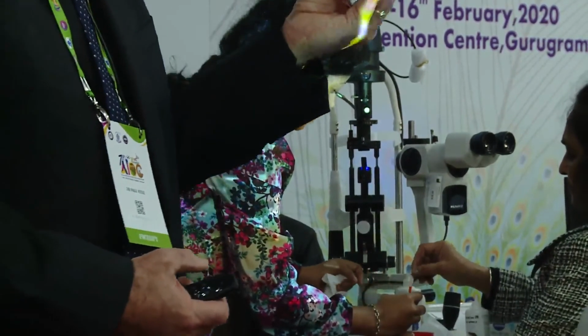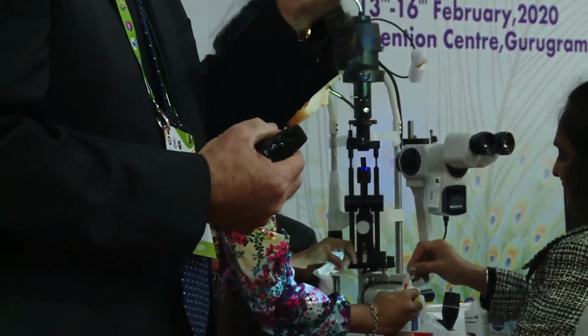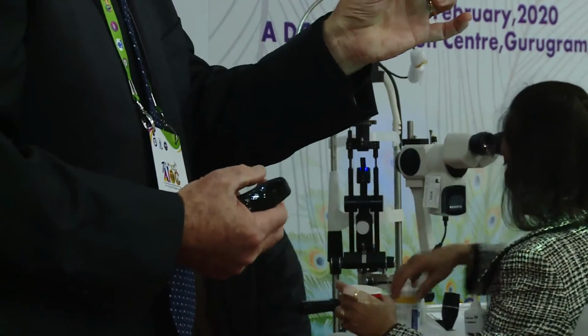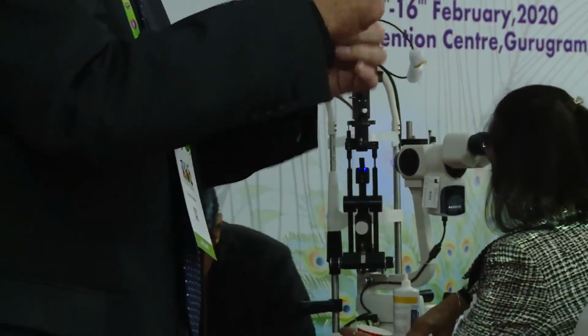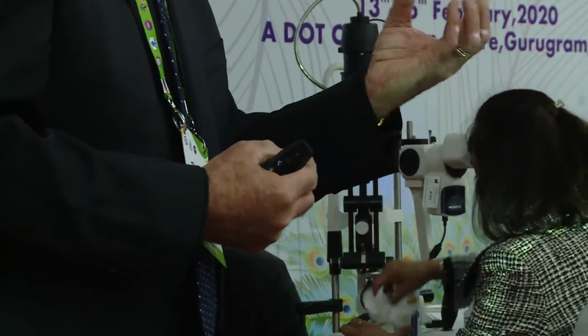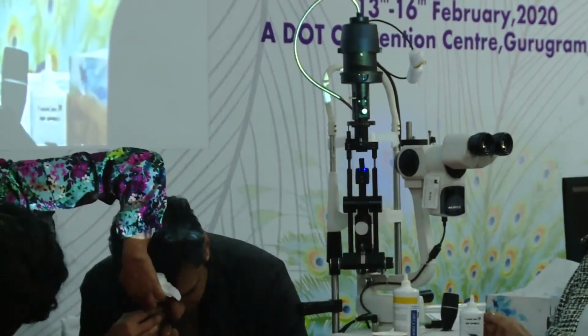I prefer a large plunger, and I cut the bottom off. All you do is moisten the top of it and place your lens on it. I cut it off so it actually has no force. It just sits there. And that's very successful.